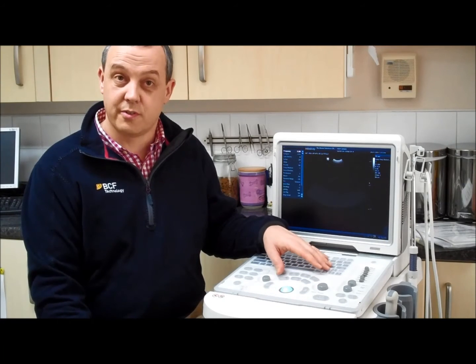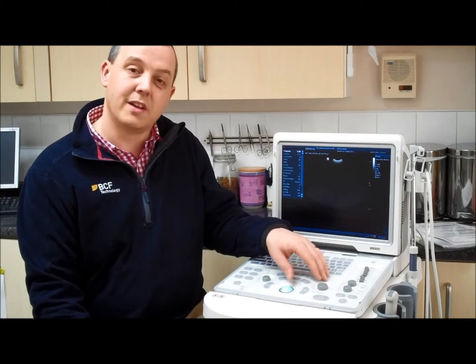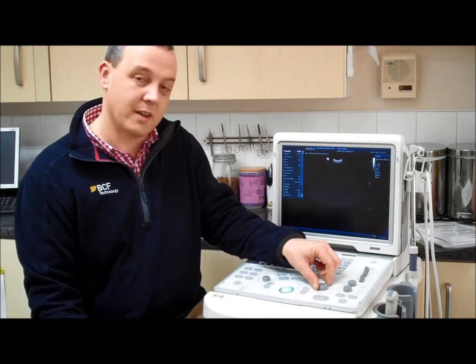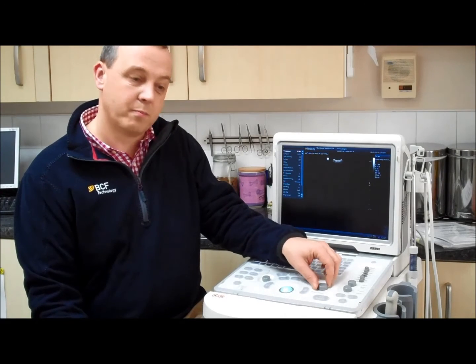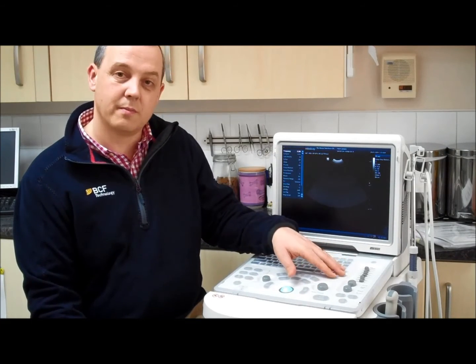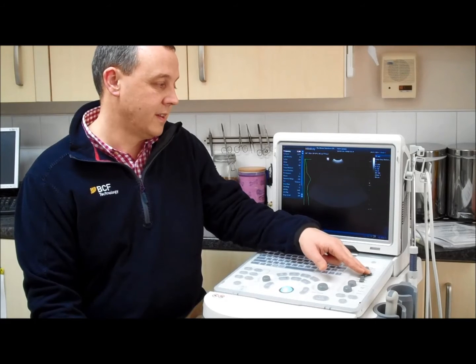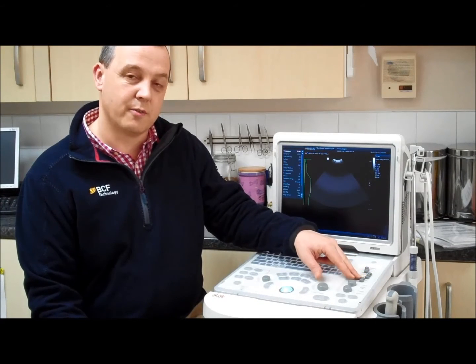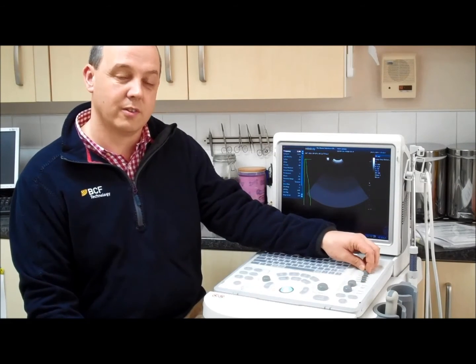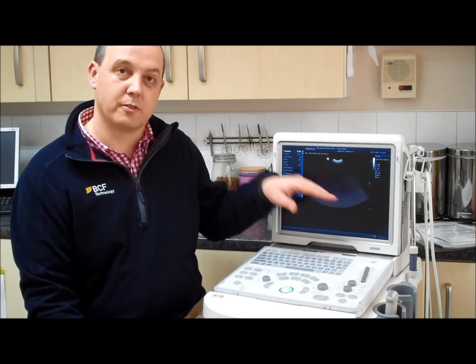Finally, if you've adjusted the frequency and checked your contact with the animal is good and the image is still dark, you may need to adjust the gain control. The gain control is a bit like volume control on your television and will increase or decrease the brightness. Rotate the knob marked gain to increase the brightness. The gain can also be adjusted at different depths using the TGC sliders. You're trying to achieve a uniform level of brightness across the screen — sometimes you may need to apply a slope so that you amplify the far signals more than the near signals.